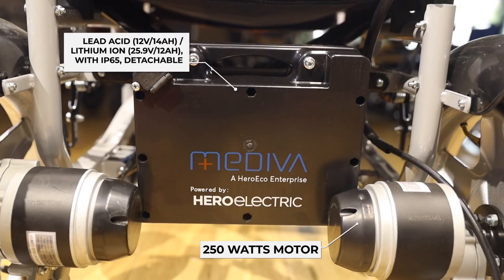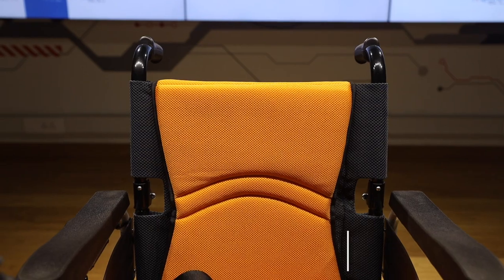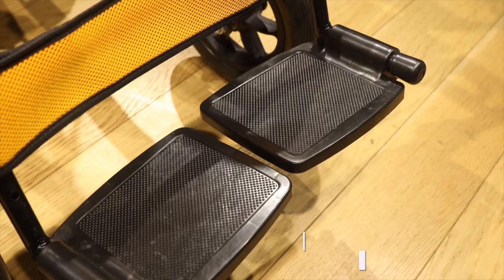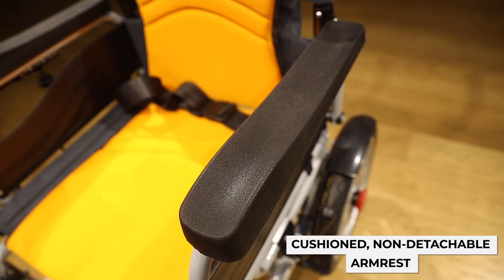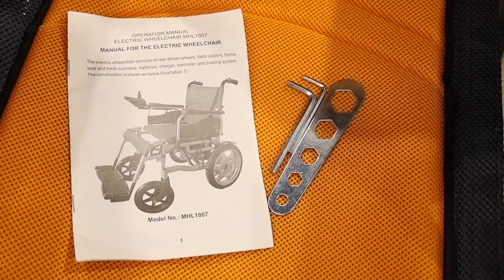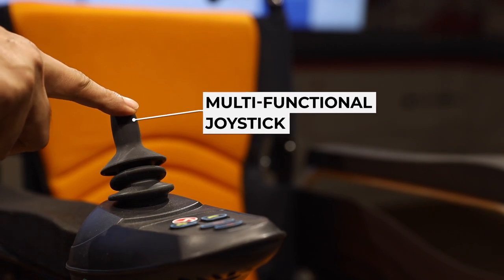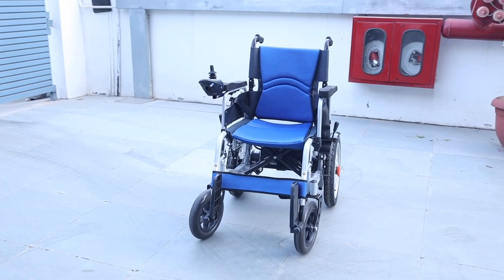The batteries are fixed firmly to the motors. The fabric used for the upholstery is fire retardant and anti-bacterial. The polymer footrest and handrest offer complete comfort. The Mediva Electric Wheelchair is provided with a back pocket to hold the tools and the manual. This economically designed interchangeable joystick provides an effortless experience and ease of operation to make your everyday ride convenient.